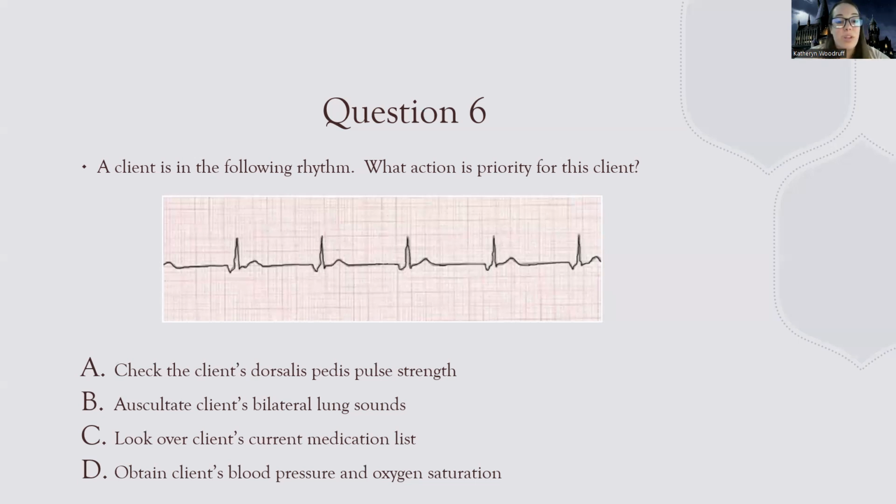And pretty much what I probably want to do is ask, how's the patient doing? And listening to their lung sounds isn't going to tell me how the patient's doing with this rhythm. I might look at their breathing and see how they're breathing, but lung sounds, or if their lungs are wet, coarse, crackles, wheezing, stridor, none of that stuff's going to tell me anything about this rhythm or change the outcome of this treatment for this rhythm. So none of that is going to be directly related, or I should say at least commonly related, to this rhythm.